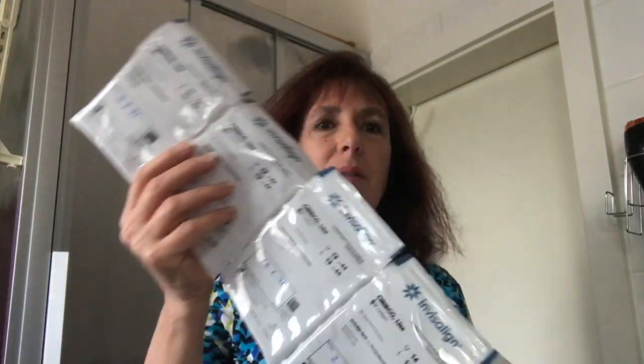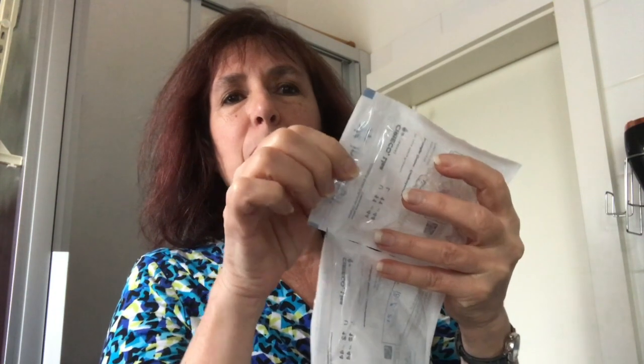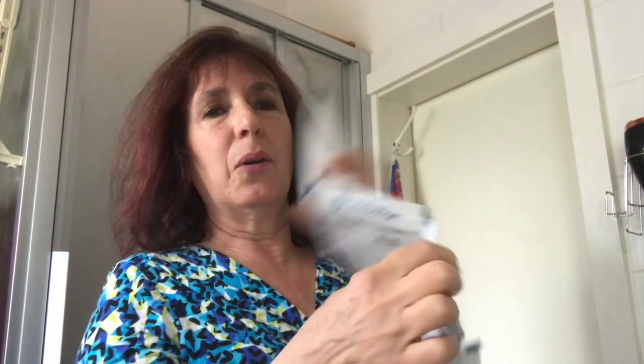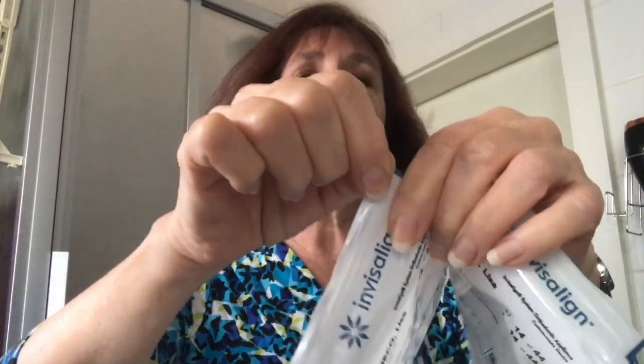I just wanted to talk a little bit about the packaging that it comes in. I was always cutting this top bit — it's like a little zip-lock bag — but my orthodontist explained to me, I mean I don't know how I didn't see this, it's actually a zipper. So just pull it off — there you go. There was some confusion about which tray set I was on and so now I'm on number 13.